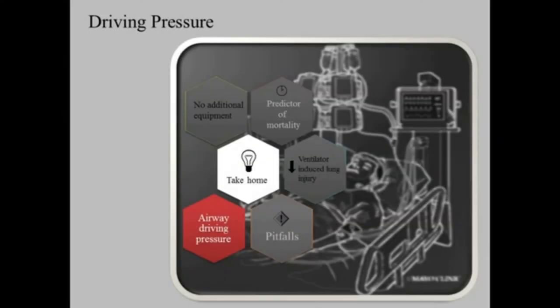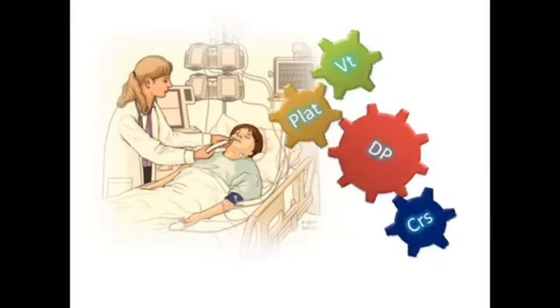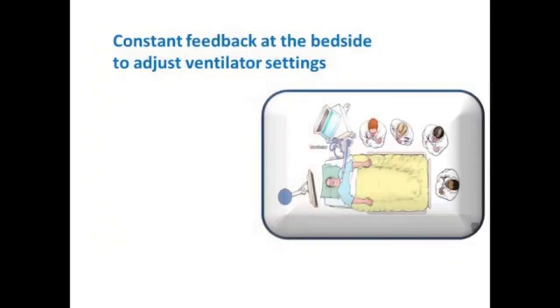The things that I would remember as a take-home from this lecture is the concept that we learned is airway driving pressure. This can reduce ventilator-induced lung injury and has shown to be a predictor of mortality. It's easy to calculate, requires no additional equipment. However, there are pitfalls to it. This begins to address the shortcomings and integrates all of the separate variables in the ventilator settings together. This also helps in providing constant feedback at the bedside for you to adjust ventilator settings. This way, driving pressure helps in personalization in the age of individualized medicine.